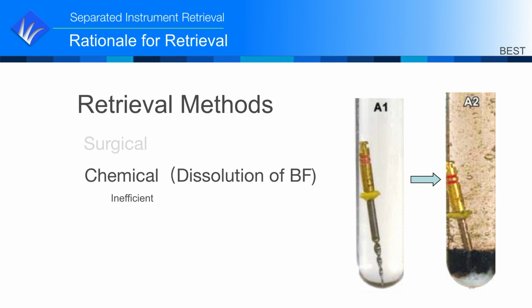Some of you out there may not realize that a nickel titanium file put in a test tube like this with sodium hypochlorite will dissolve to a bunch of black goo within about 4 hours. So we really don't want to use hypochlorite during nickel titanium instrumentation, although certainly your files should not get 4 hours of use before you move on. You hear talk about electrochemical removal also, but it's basically the same as the chemical method. But the big problem is the instrument surface in contact with the fluid is severely limited to the coronal end, and it would take days. The intriguing part of chemical removal is that we could dissolve the entire instrument and have no dentin sacrifice required.